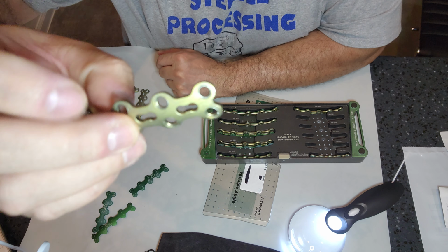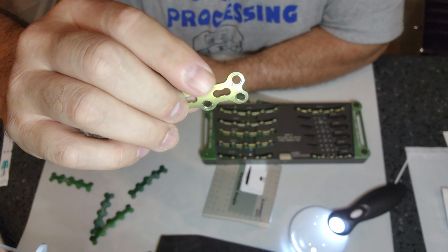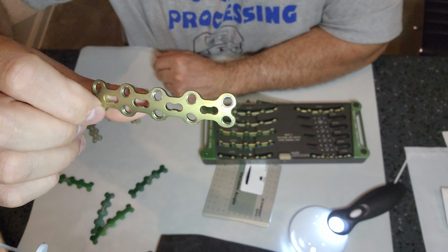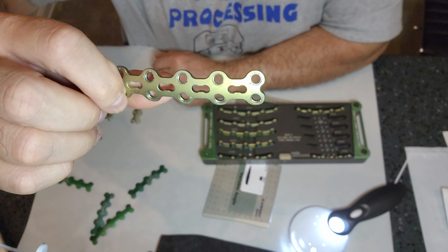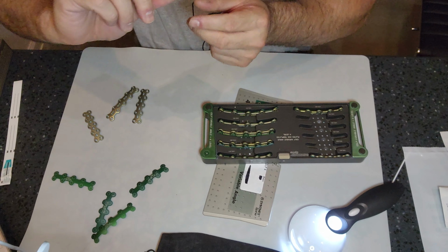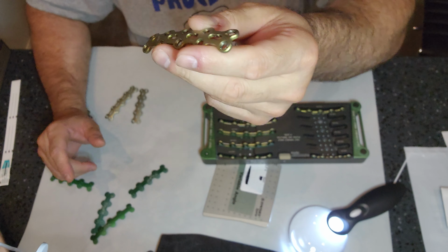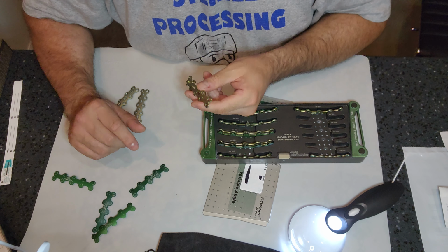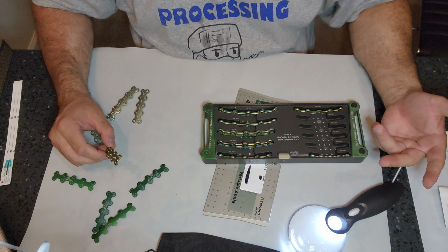What happens when you find bioburden on an implant? What should happen to this implant? Should it be cleaned and reprocessed, or should it be discarded? And is that bioburden tissue, or is it something else? Let's stir that pot on that one. But this set is contaminated.